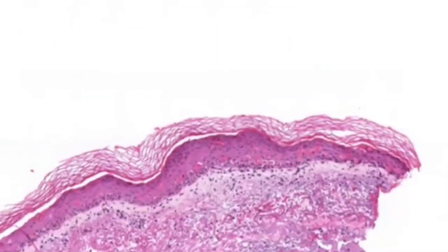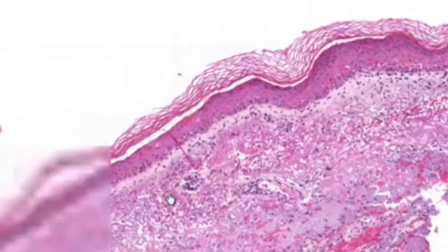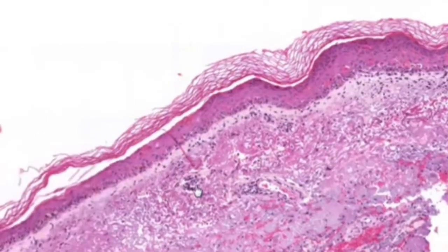Now, this specimen also emphasizes that the inflammation present in Erythema multiforme tends not to be very heavy. There are cases where you can see more of a lichenoid inflammatory infiltrate, but in this particular instance we have more of an interface inflammatory infiltrate composed predominantly of lymphocytes. Certainly some histiocytes are present.